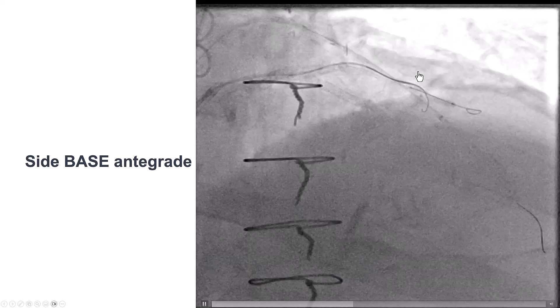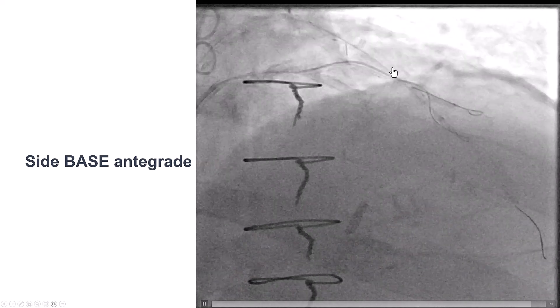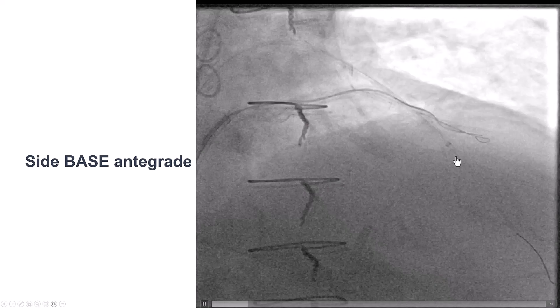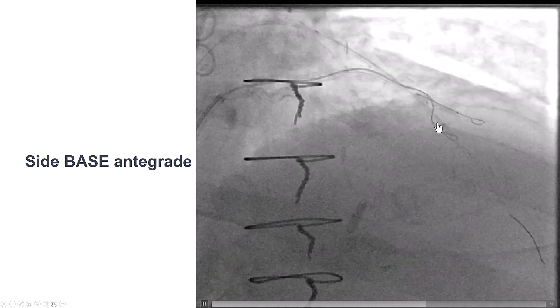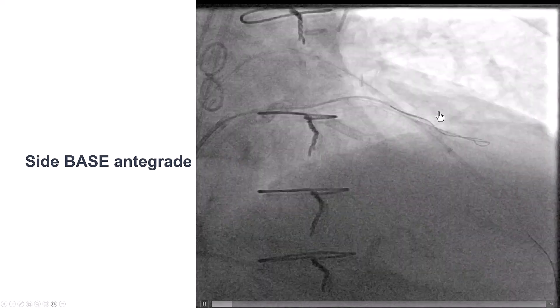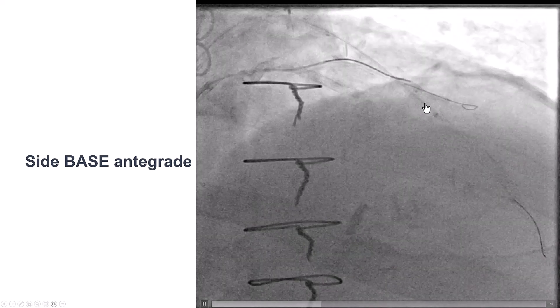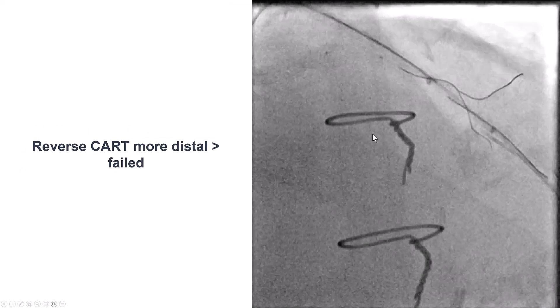After multiple attempts, we decided to modify the plaque on the antegrade side, since we now knew where the distal vessel was. We advanced an antegrade wire and were able to get an antegrade knuckle going, then inflated multiple balloons into the LAD to cross the cap — using 2.0 and 3.0 millimeter balloons. Unfortunately, we still could not get the microcatheter to advance.